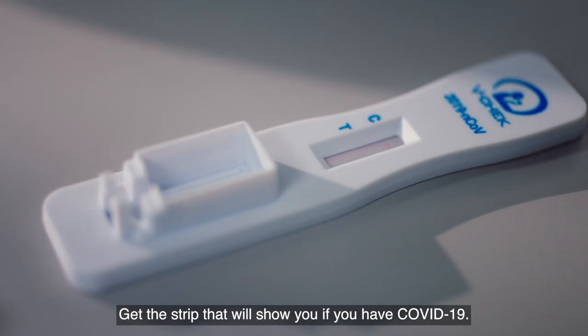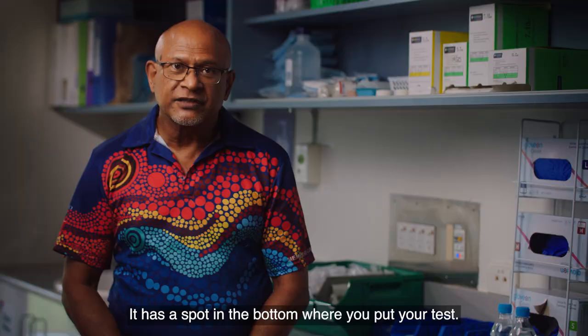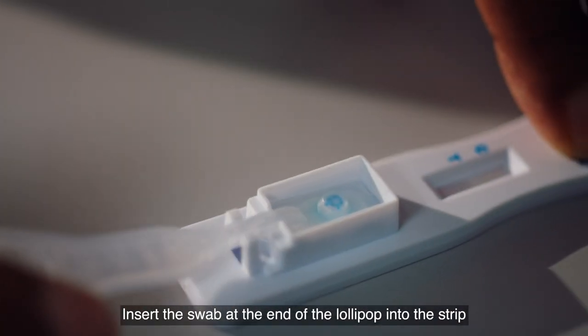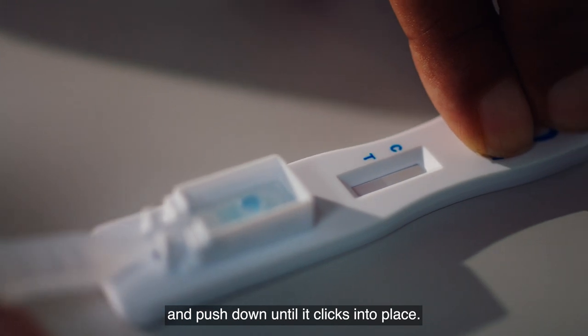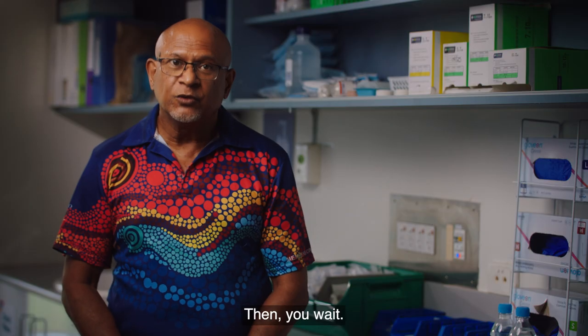Get the strip that will show you if you have COVID-19. It has a spot at the bottom where you put your test. Insert the swab at the end of the lollipop into the strip and push down until it clicks into place. Set your timer for 10 minutes, then you wait.